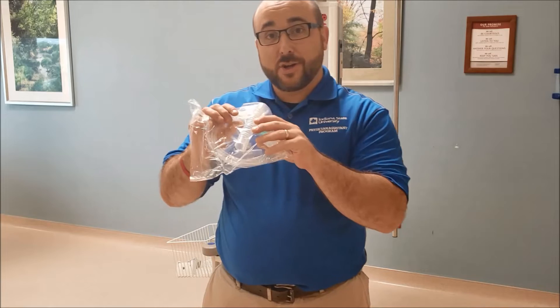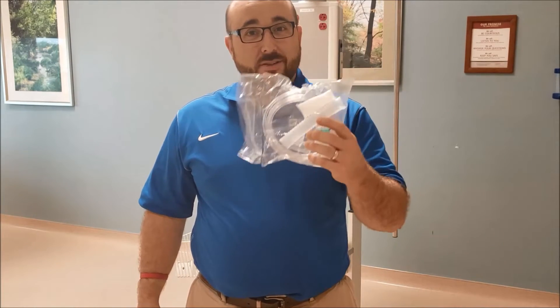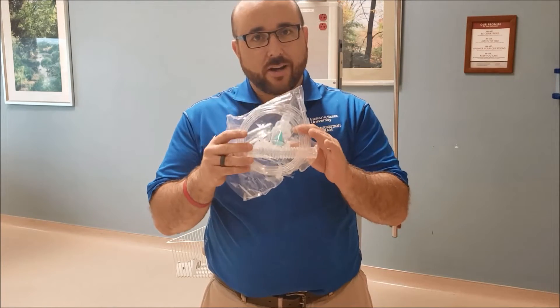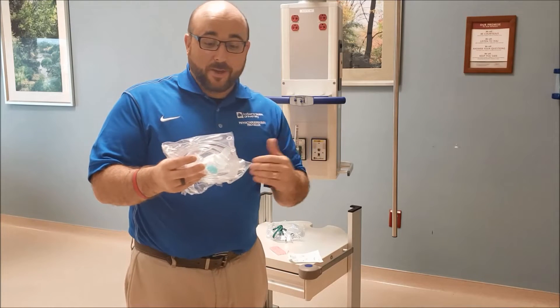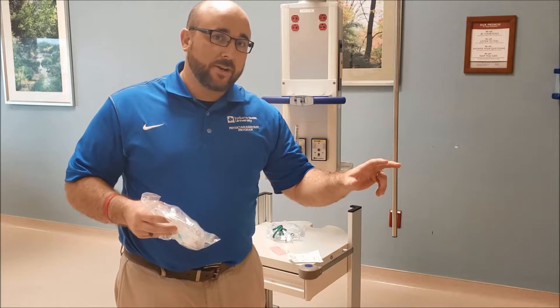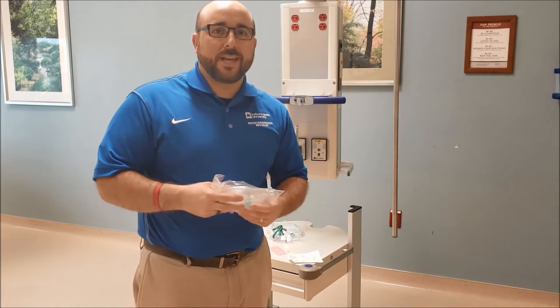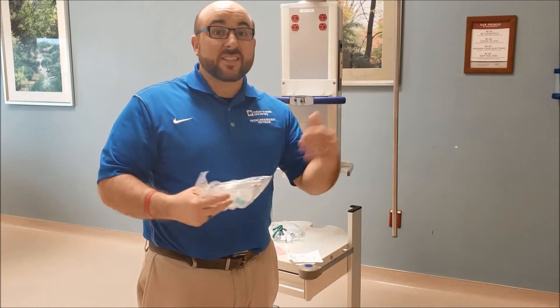We are going to show today how to give a standard nebulizer treatment. We call this a T-neb — it can be called whatever — but this is your standard generic nebulizer. I'm going to show you a little bit of how to put the medication in, teach the patient their breathing pattern, and then some parts of your assessment while you're watching them take the nebulizer and then after. So let's get to it.